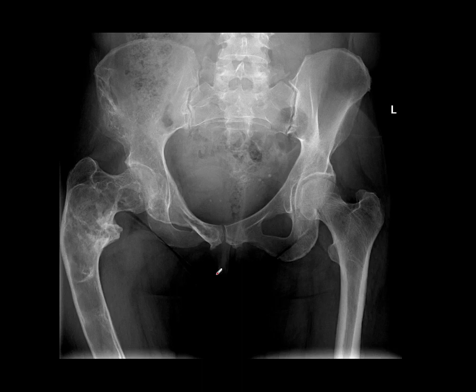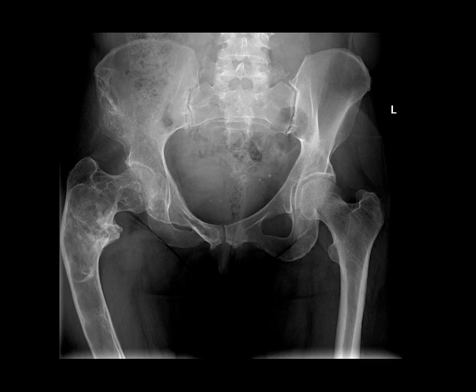Metastases don't wait for that sort of thing — they just destroy bone as they go along. But benign, slow, or congenital processes will cause modelling deformity, a slow change in the shape of a bone, just like water over many years will erode a rock. This is the classic appearance of fibrous dysplasia, a benign bone condition predominantly affecting the lower limb, with bone textural abnormality also visible in the pubic bone and iliac wing.